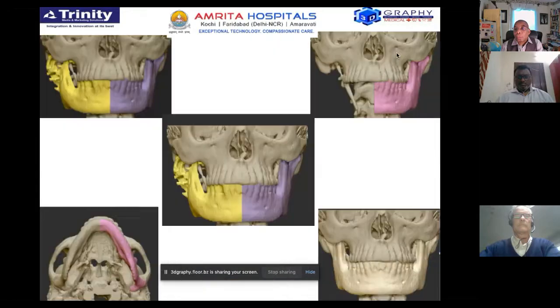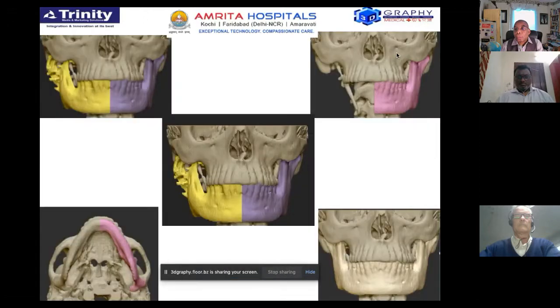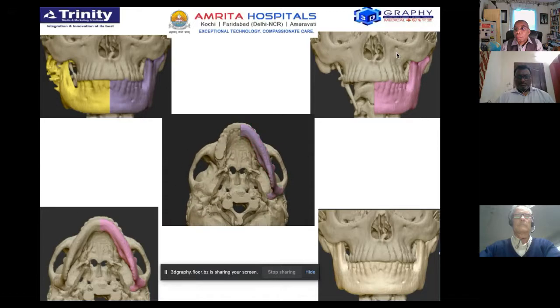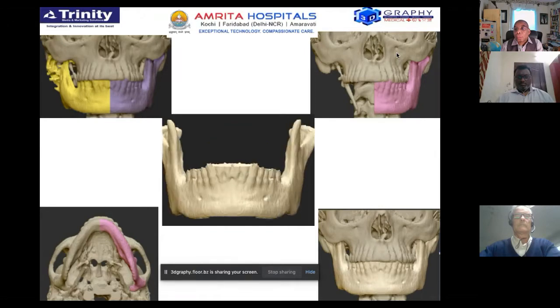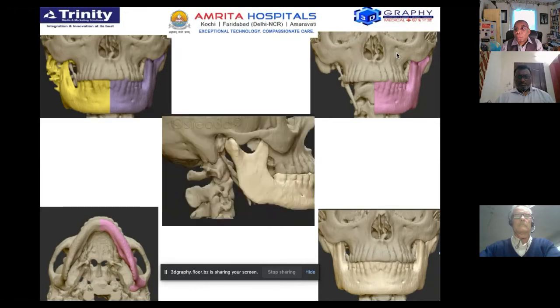As a general principle, we went ahead taking the CT scan and understanding how big the lesion is, and we had an idea of how much of the mandible was going to go. So what we did is, if you have a lesion on one side, you usually mirror or flip the side, and you have to make a normal mandible so that you can bend a reconstruction plate and then take it forward.